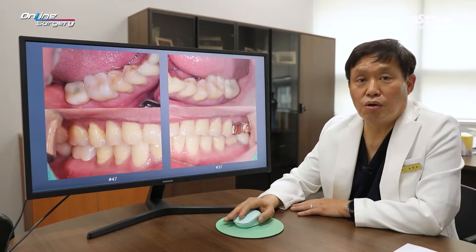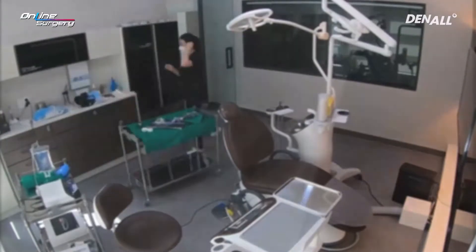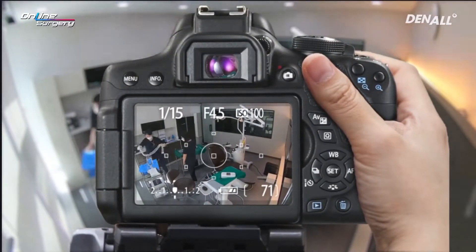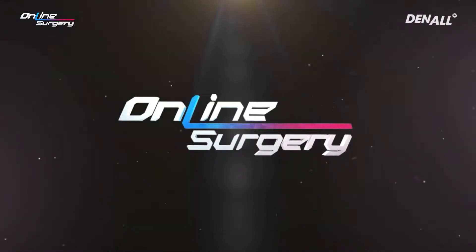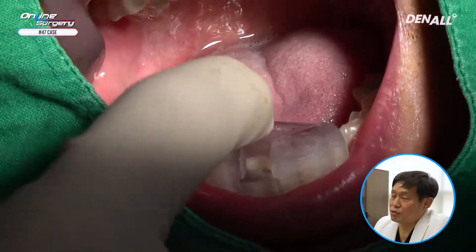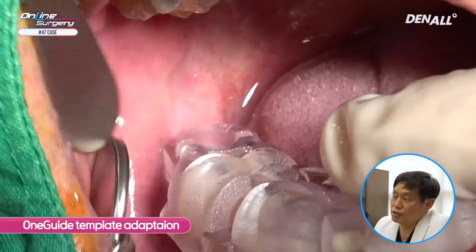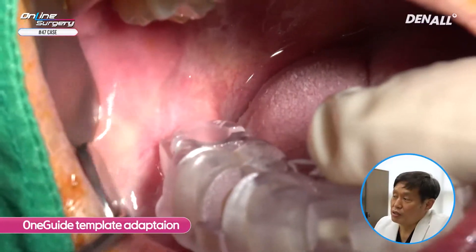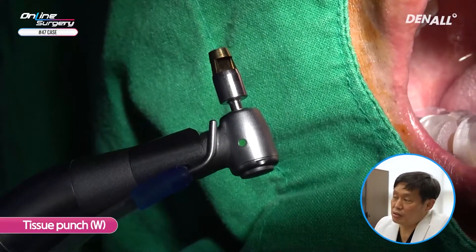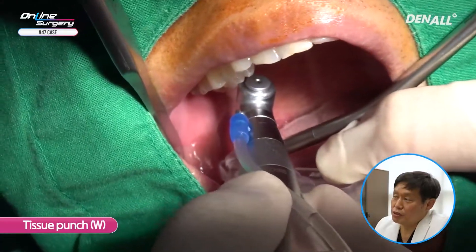The surgery itself was not difficult. Let's look at the surgical video. First, I'm placing the one guide template to adapt it and check the adaptation for surgery on number 47. There was sufficient attached gingiva, so a tissue punch was used for the surgery.